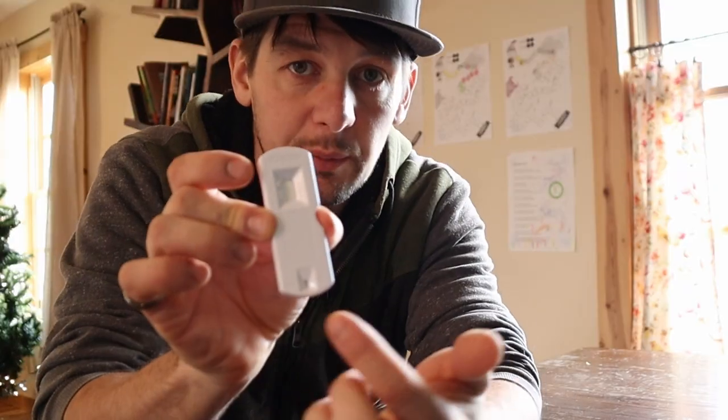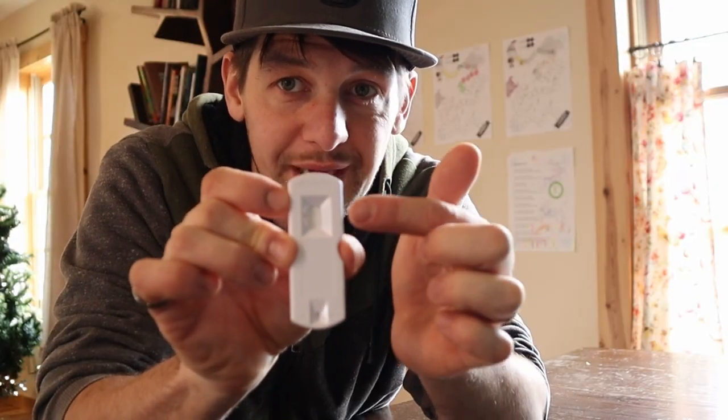Good girl, Maddie. As soon as you get the blood sample you're supposed to invert it 10 times. It says it's a very important step. I didn't get it done right away but it's still flowing nicely, so that should work fine. Now we'll see what the next steps are — we're going to put the blood in here and the results will show up here.